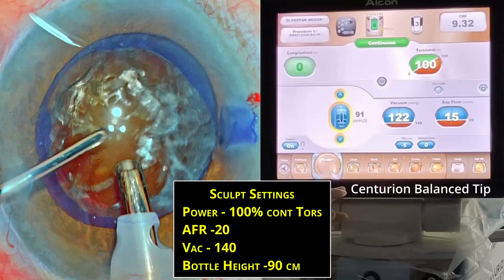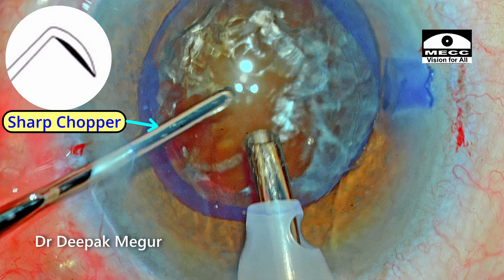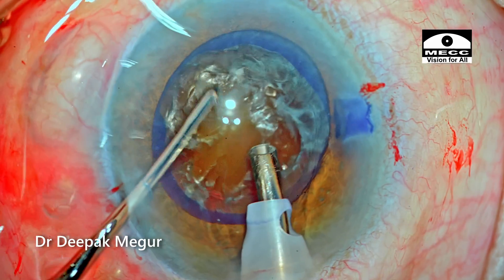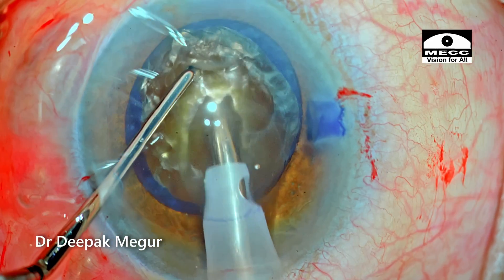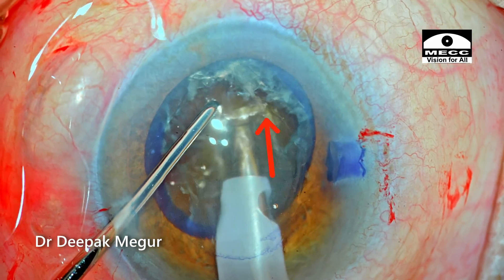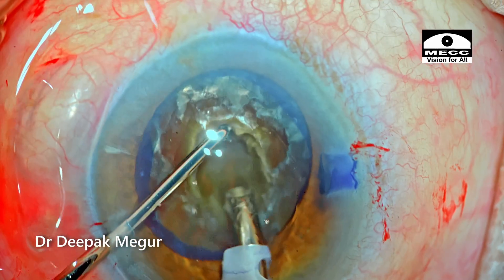These are the sculpt settings used for this nucleus density. I'm using a sharp chopper to deal with this dense nucleus, and note that the exposed part of the tip is slightly longer — I consciously use this when dealing with a harder nucleus. It gives a longer tip length to bury deep into the substance of the nucleus. The nucleus is stabilized with the chopper as I sculpt down. The sculpting length is about 2.5 to 3 mm and this trench will be dug to at least 80% depth.